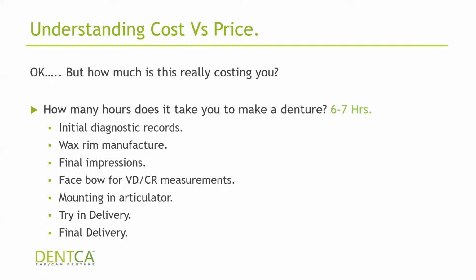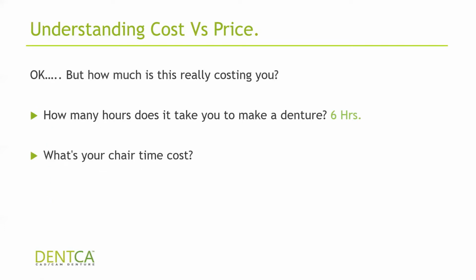I need to do diagnostic records, wax rims, final impressions, and do a face bow, or have another way of making VD and CR measurements, maybe in other ways that are a little quicker, but you have to mount it in the articulator, then you have to do a try-in delivery, you have to do a final delivery. So that's usually how much it takes all across the board during different appointments.